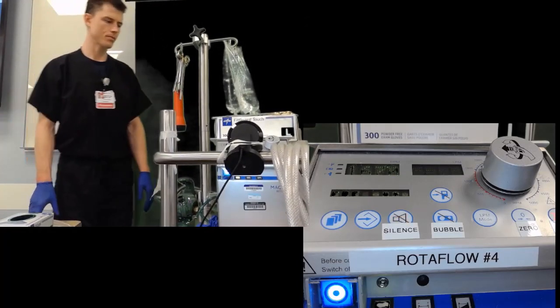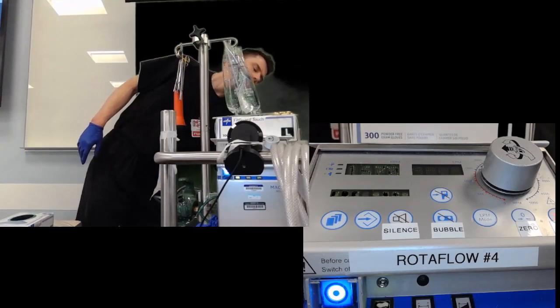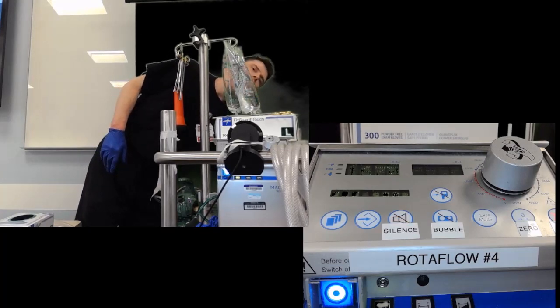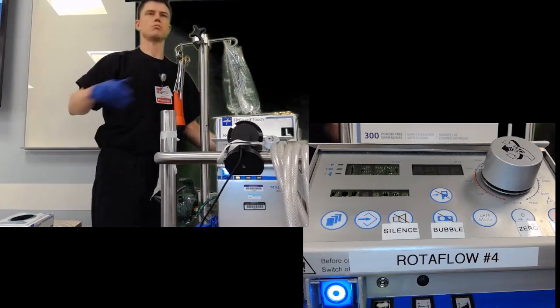You guys can come all the way up if you want to, just because it's hard to see. In the back here is our pump head, and there's a little flow sensor within this black thing here, and it needs gel in order to sense how much flow there is, and right now it's out of gel, it's dried up. And this can happen if you have a patient who's been on for a long time.